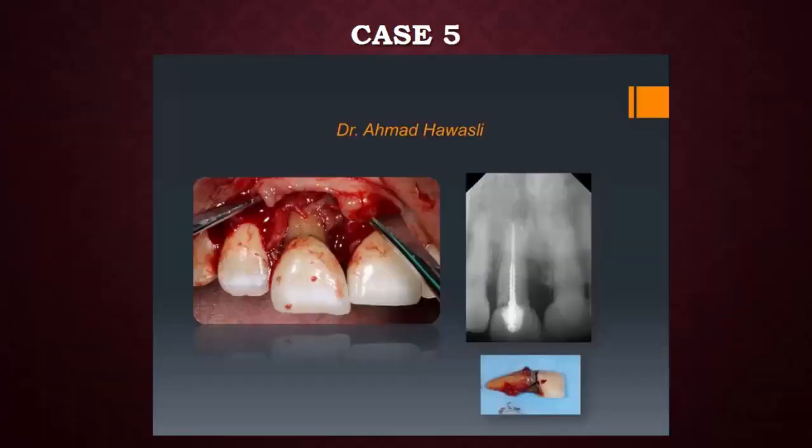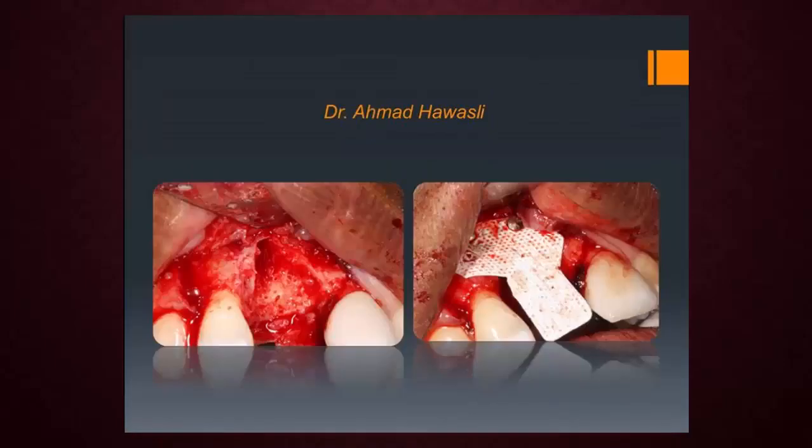And this is also another case. Here the patient had a root fracture, as we can see in the picture. So we now extract the tooth, and here we can see the amount of bone loss and the defect, the complete loss of the buccal plate.